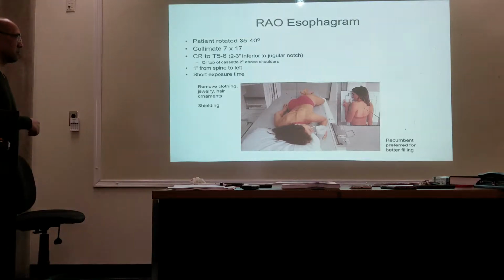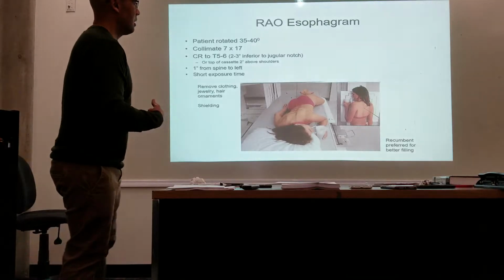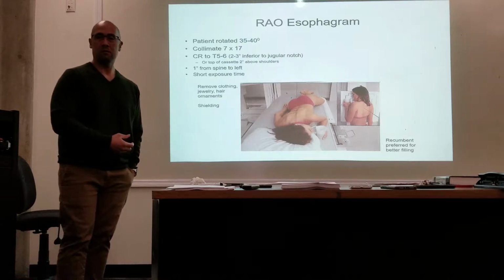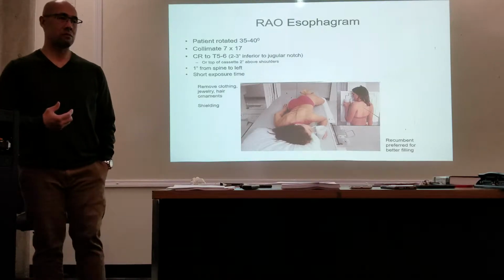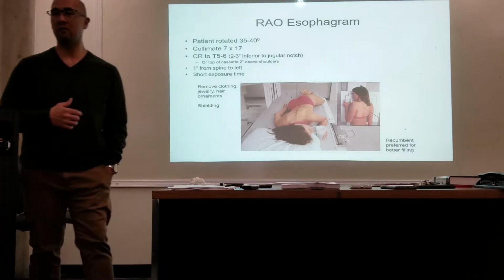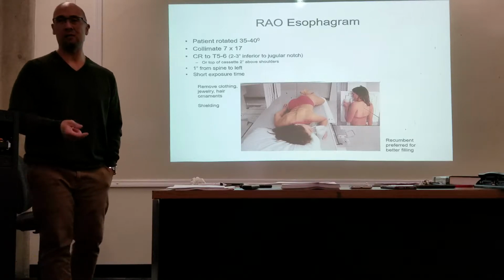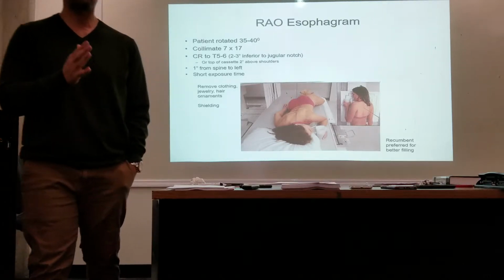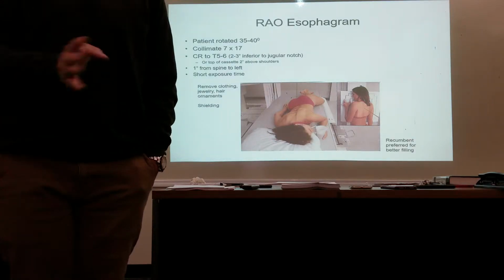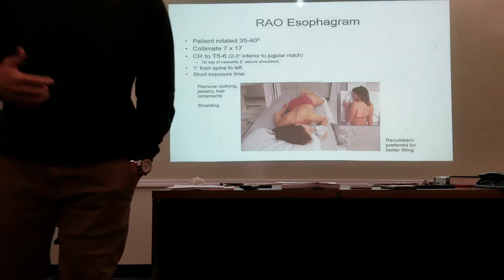Okay? Now this is the way it's going to go. So you give them the cup of barium with a straw. You're going to tell them to start drinking. So, Miss Jones, in a minute here, I'm going to start taking some pictures of your esophagus. What I want you to do is continue drinking. I'm going to tell you to drink and swallow, drink and swallow, drink and swallow. And you continue to drink. Don't stop until I tell you to stop. Do you understand that, Miss Jones? She'll say, okay.